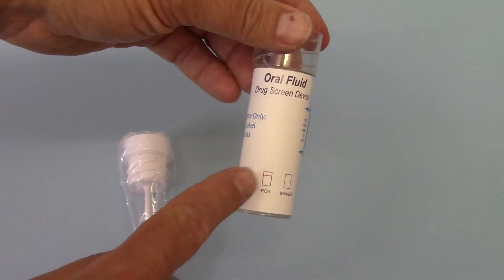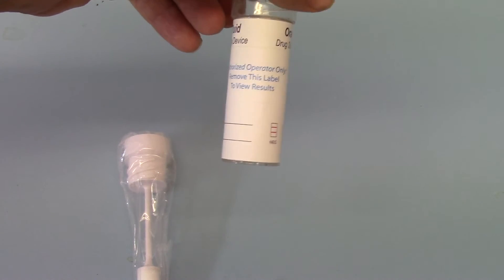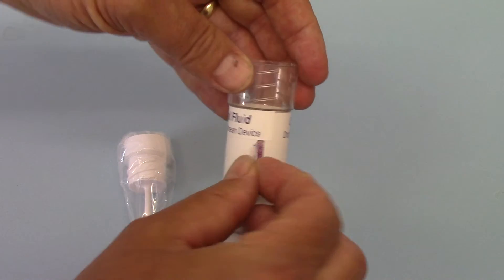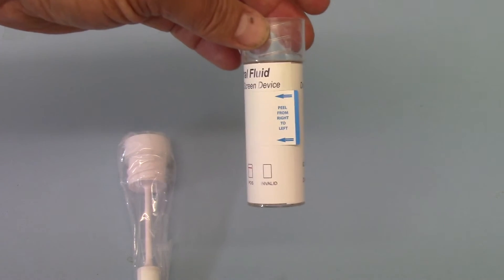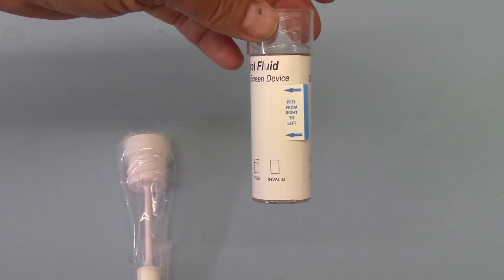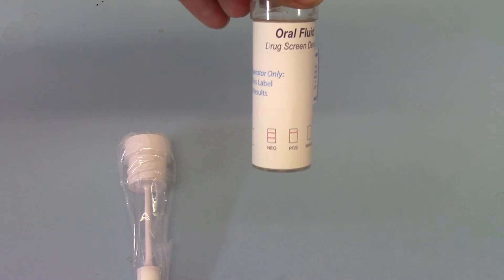And on the side here you've got basic information on how to run the test and interpret a negative and a positive result. The results appear under this label here. Now you can either choose, depending on your procedure, to remove that before running the test, or it can be removed at the specified read time and the results displayed.